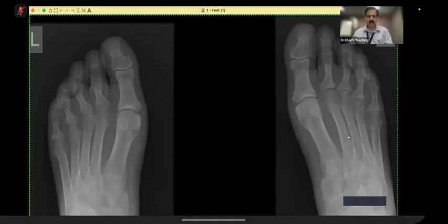And that age group doesn't go with CPPD. It doesn't go with gout for the simple reason that the pattern or the joint involvement is not first metatarsophalangeal. The erosions haven't got overhanging edges. The margins of the erosions are not sclerotic. So you are left with rheumatoid arthritis.